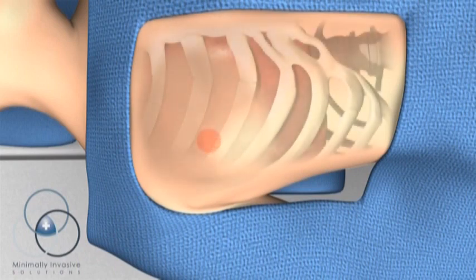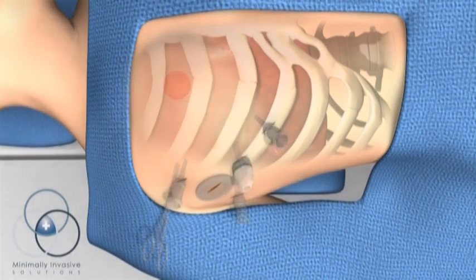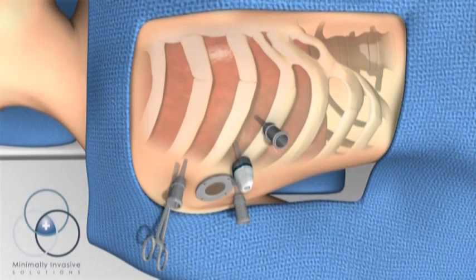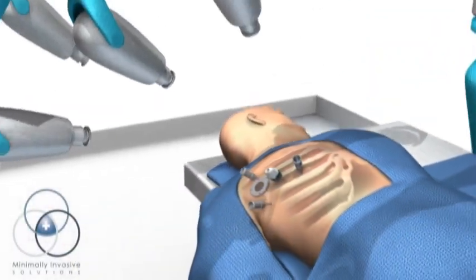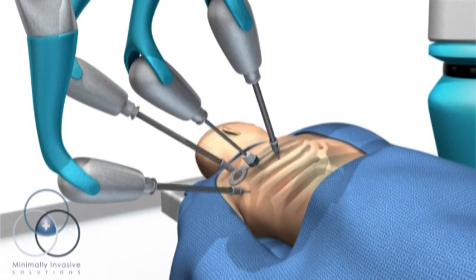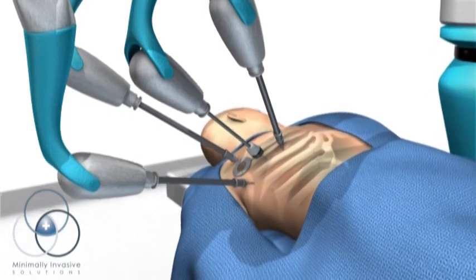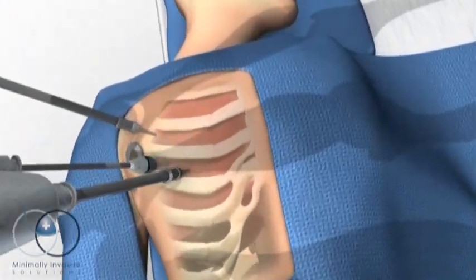For women, the right breast is gently retracted while the surgeon makes five small incisions in the patient's side, four that are less than half an inch wide. The surgeon attaches the robot to the patient through thin tubes called trocars, which allow the instruments and camera to glide smoothly during the procedure.